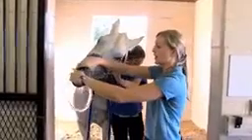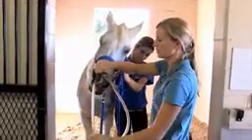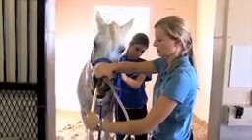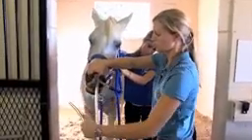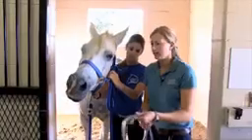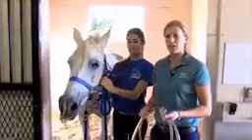And you want to make sure to keep their heads nice and quiet when you're doing this, because when you pull it out through their nose, it can flick up and give them a bloody nose at that time too. So you just pull it out nice and slowly. And that concludes how to give a medication by a nasogastric tube.